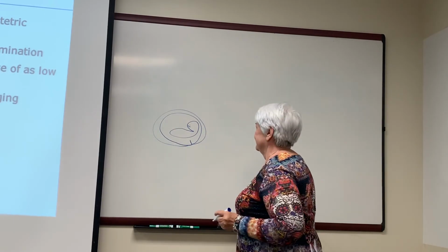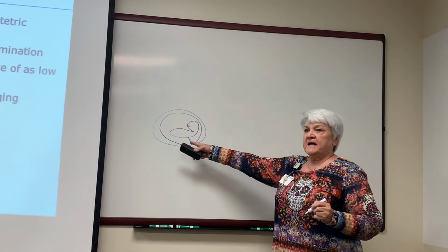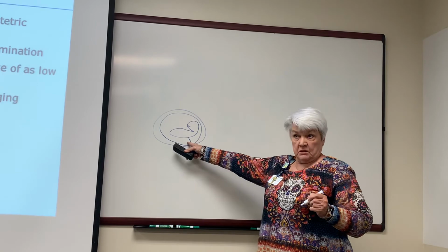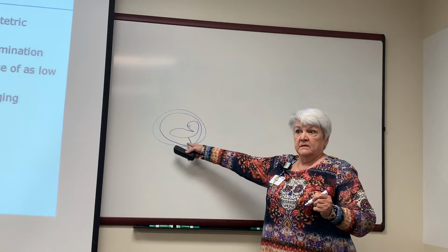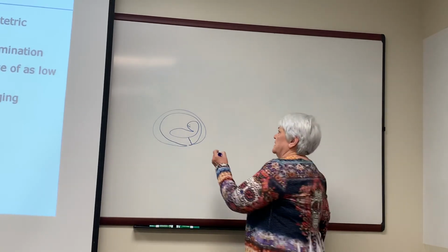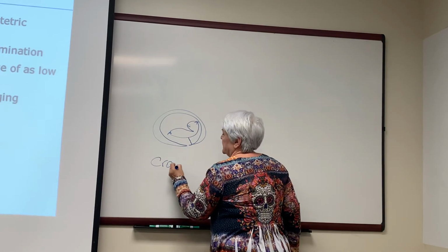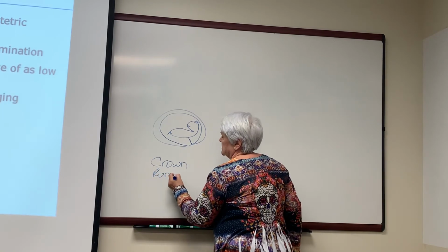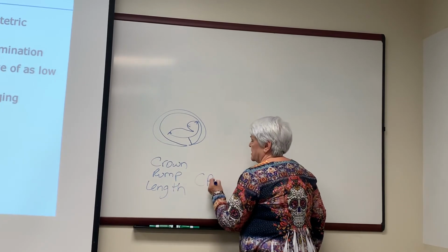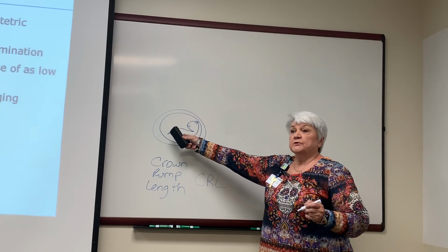As the baby's growing, it's attached to the chorionic cavity by a yolk stalk. That's before the umbilical cord even starts forming. I'm going to measure this. That's called a crown rump length, or CRL. This is done up until 13 weeks, 6 days.